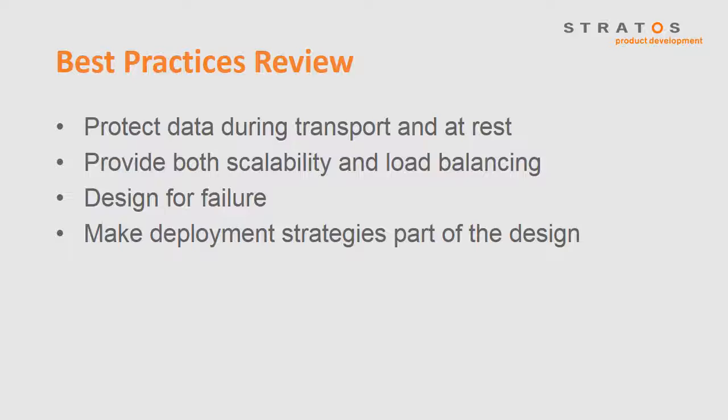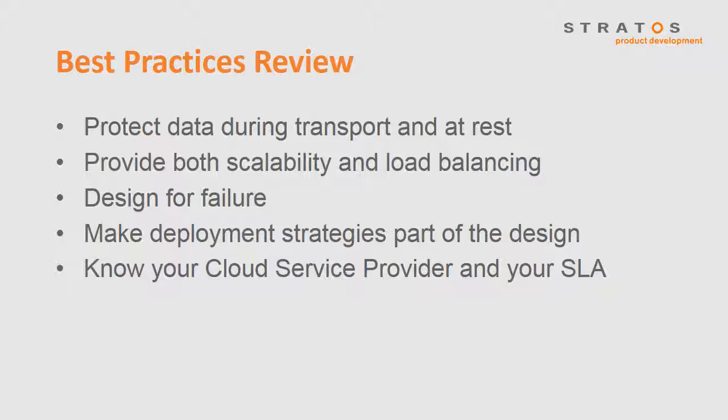Deployment strategies that we haven't talked about yet include configuration, rollout and rollback, and bug fixes. Become familiar early on with what your cloud services provider has to offer and what their limitations are. And put your team together early on and use them well.